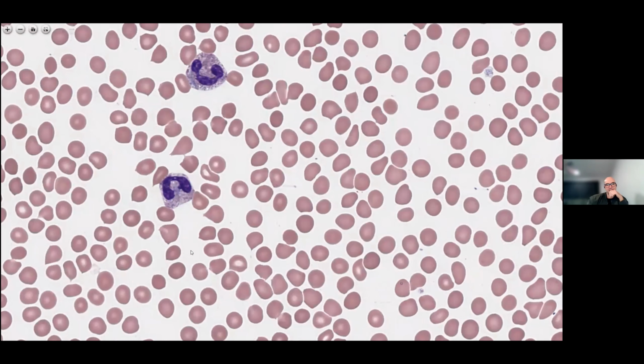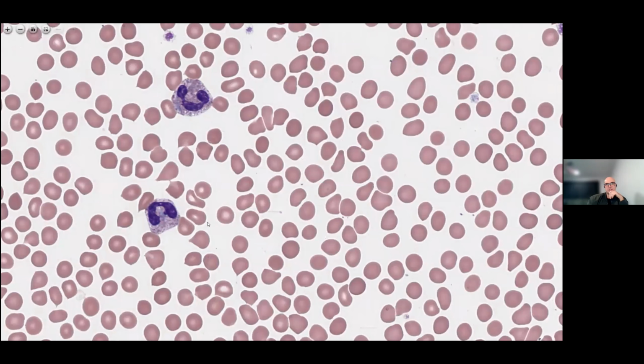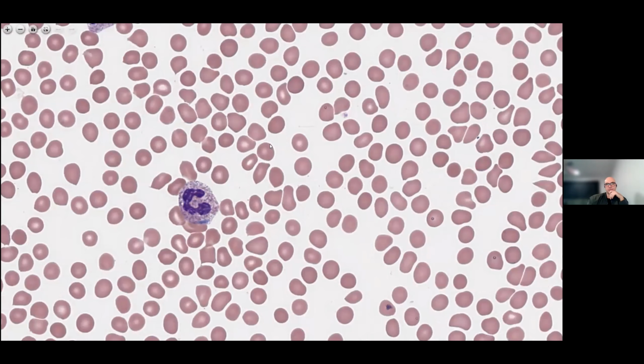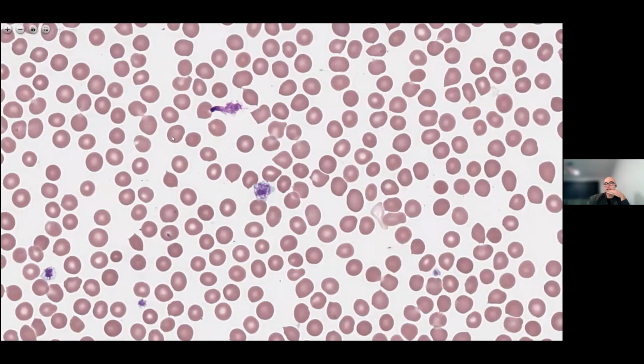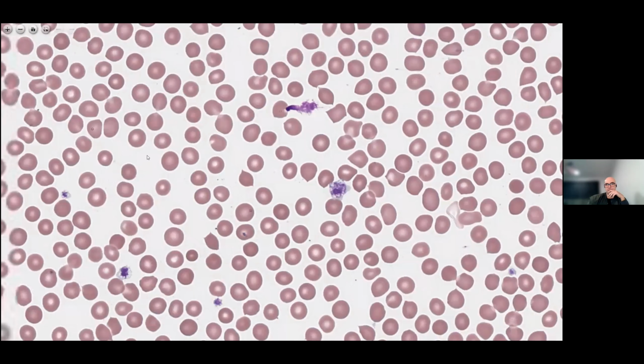It's a really interesting case, this one, because it's the point that you made: have a look at a previous count. Has it been low before, and what else is going on? Maybe this is a very first blood count we've seen for this individual as well. Yeah, and it can be difficult, but if you just go back to the neutrophil again, Joe.